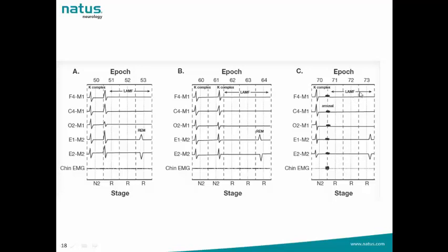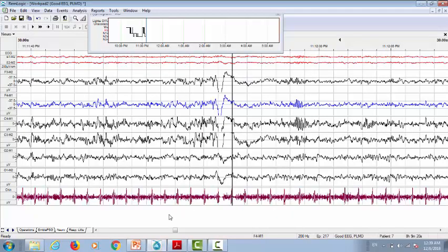No clue. We'll go to 73. This is phasic REM episode. This is definite REM. We go back and score 72 and 71 as tonic REM. So these rules should only be applied when you have absent tone. According to that, what we see here is absent tone.